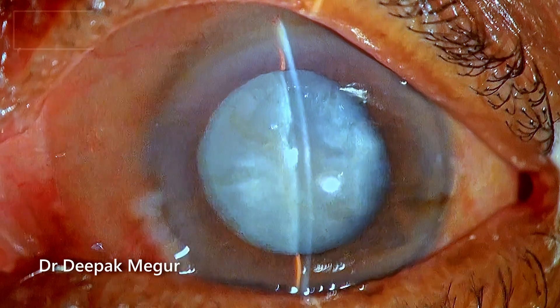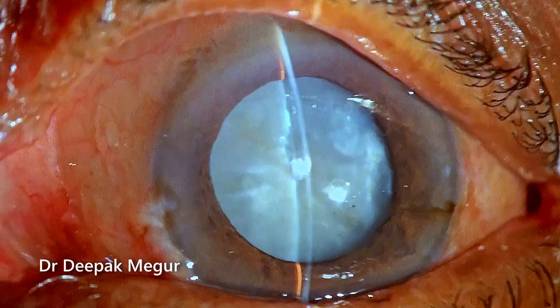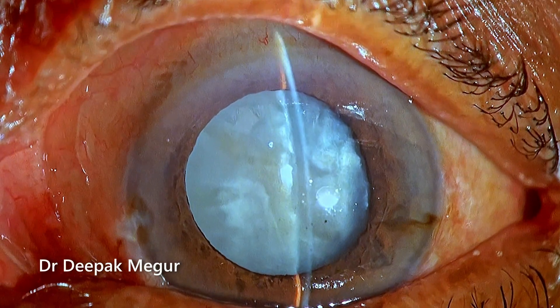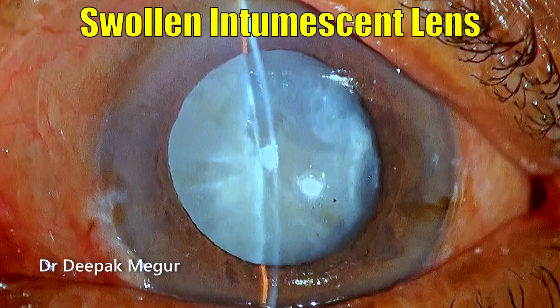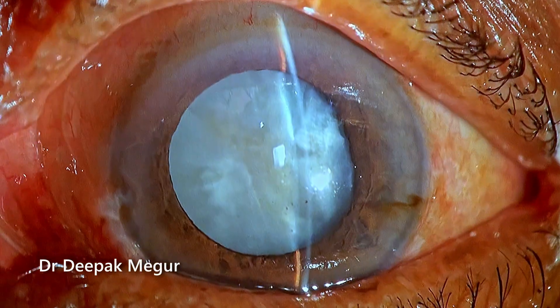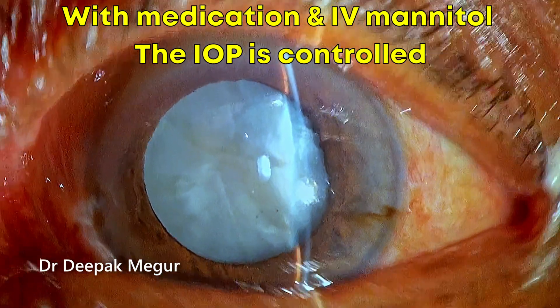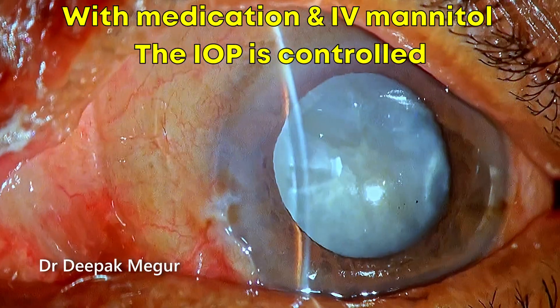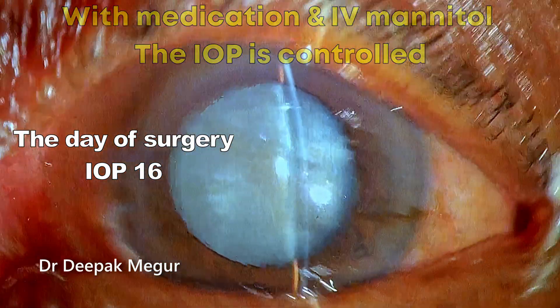This is an 85-year-old elderly male patient who has presented with a phacomorphic glaucoma. The anterior chamber is extremely shallow and he has a swollen intumescent lens. The pressure at presentation was around 50 millimeters of mercury and the eye was inflamed. With medications, the inflammation and pressures have been controlled, and the pressure today is around 16 after IV mannitol.